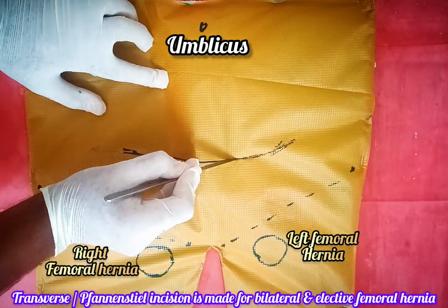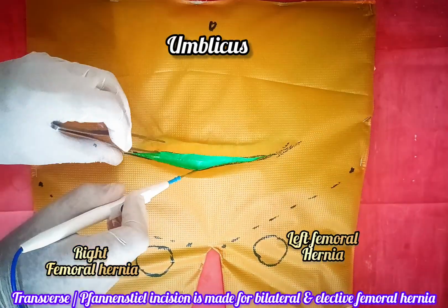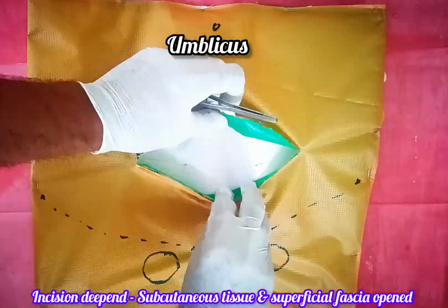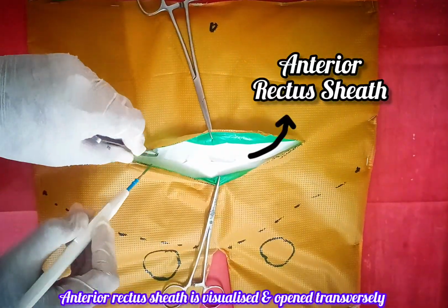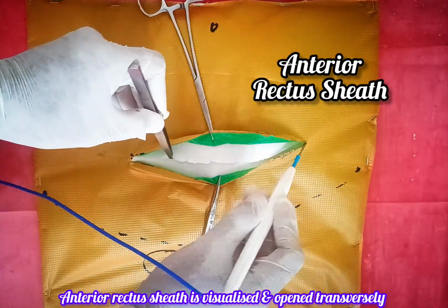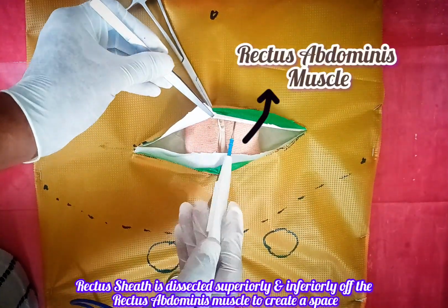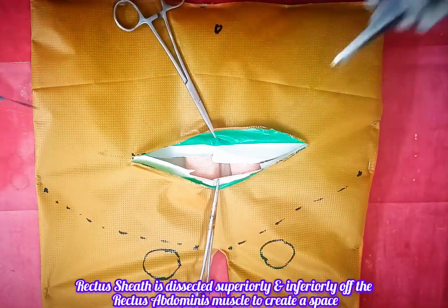Transverse or Pfannenstiel incision is made for bilateral and elective femoral hernia cases. Incision deepened and subcutaneous tissue and superficial fascia of anterior abdominal wall are opened. Anterior rectus sheath is visualized and opened transversely. Rectus sheath is dissected superiorly and inferiorly off the rectus abdominis muscle to create the space.